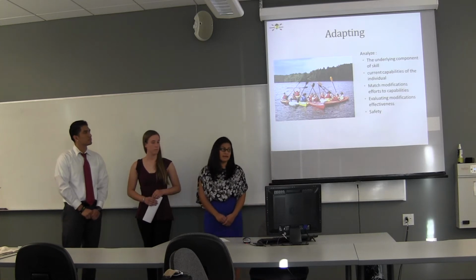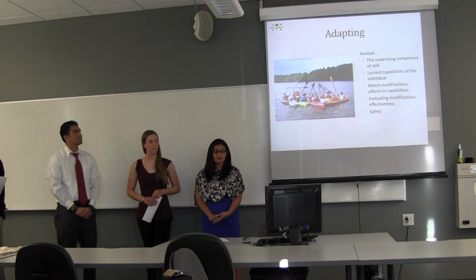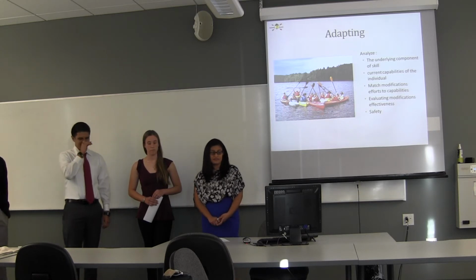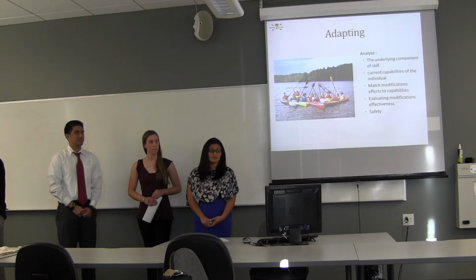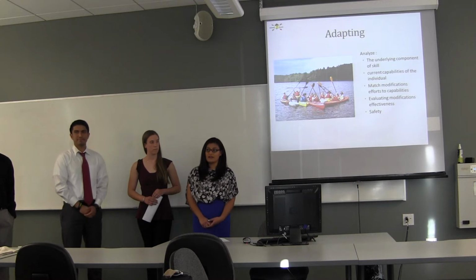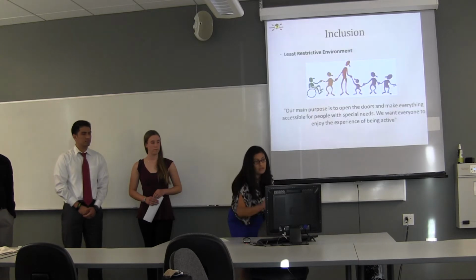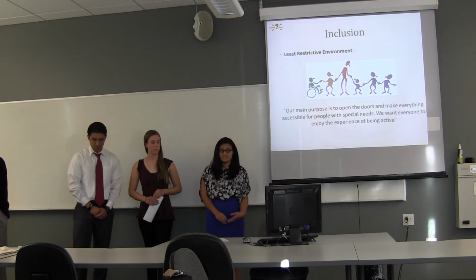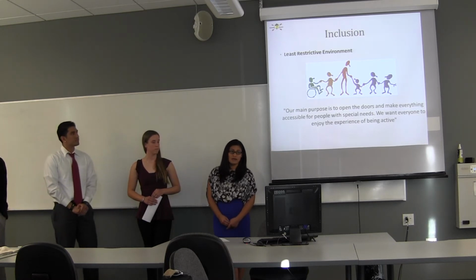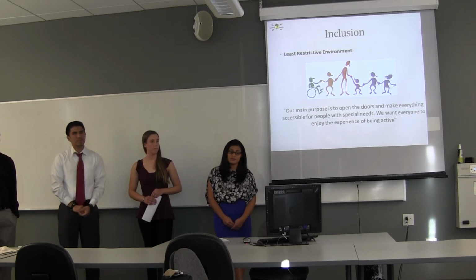So whenever we have to adapt a device, we want to make sure to analyze the underlying components of the skill, the current capabilities of the individual, and match the modification efforts to capabilities, evaluating the modification effectiveness and safety. Because we're developing this device for Disabled Sports Eastern Sierra, they have a wide variety of athletes that range in ability levels, so we need to accommodate for that. To do so, we are implementing the least restrictive environment, as Jen said. This quote is directly off of their page. They want to be able to provide the facilities to as many athletes as possible, so we're going to help make that possible.